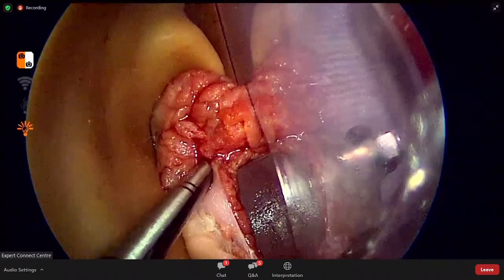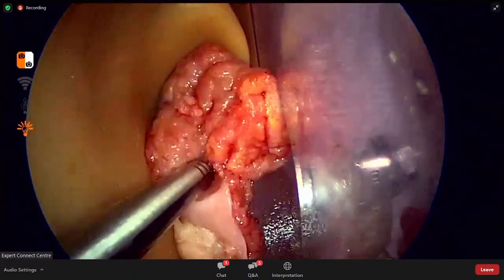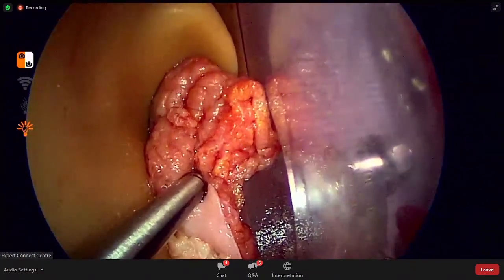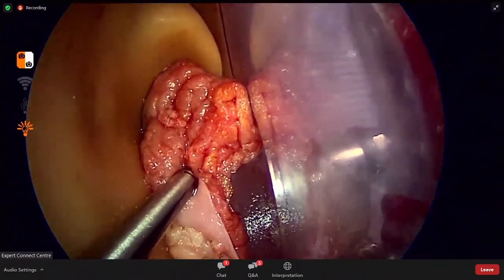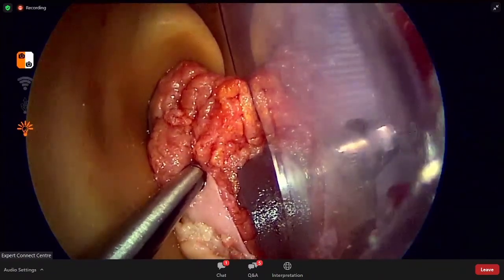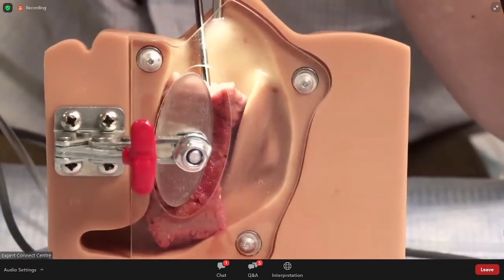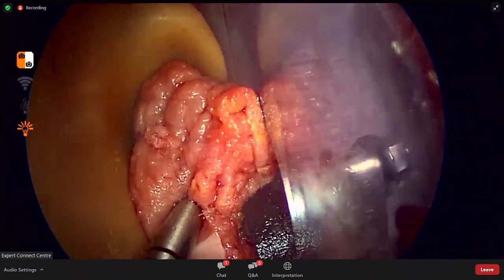how things are looking, and you can see the depth there. So we're literally at the third band. So we are approximately 4.5 centimeters in, and doing this endoscopically then allows you to inspect where the tip of the turbinator might be, whether it's still within the substance of the turbinate or has it perforated. So again, let's step on the ablate pedal. And as you do that, you can slowly withdraw.